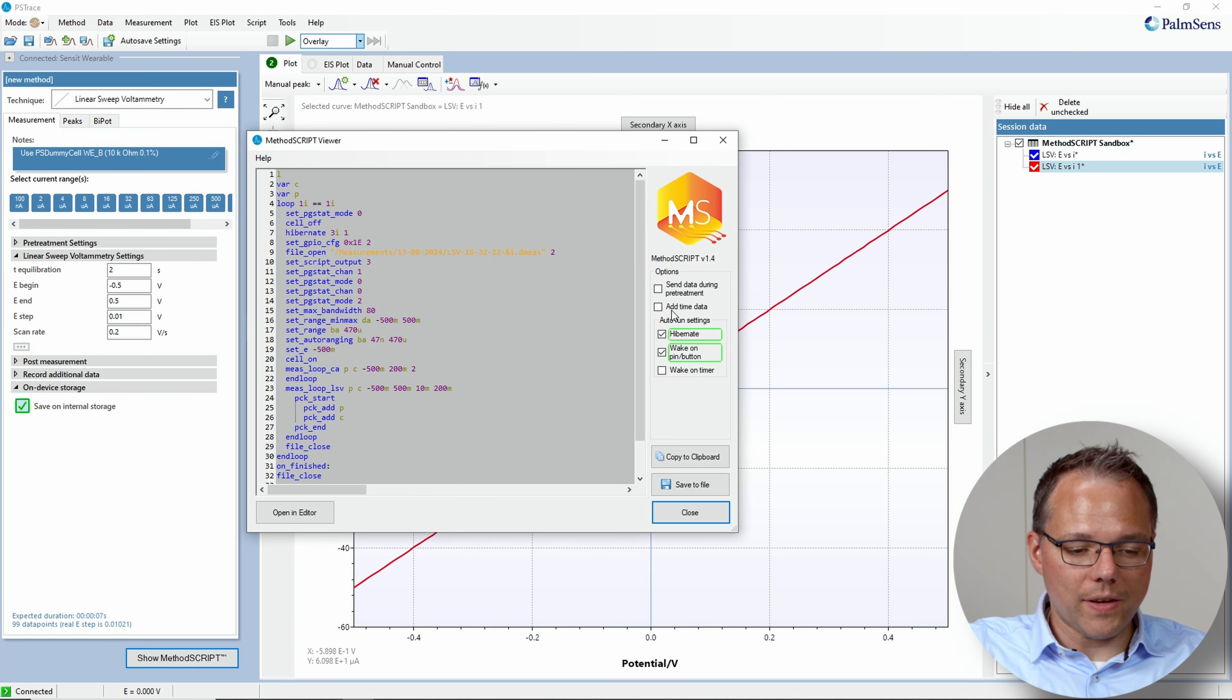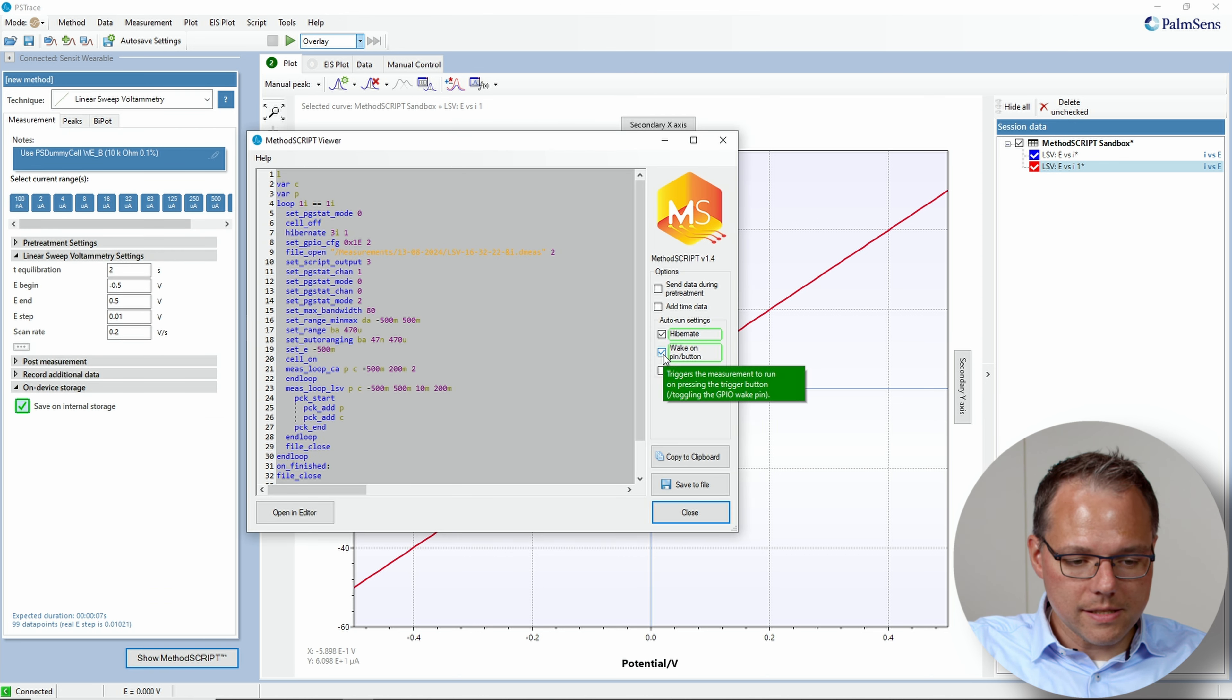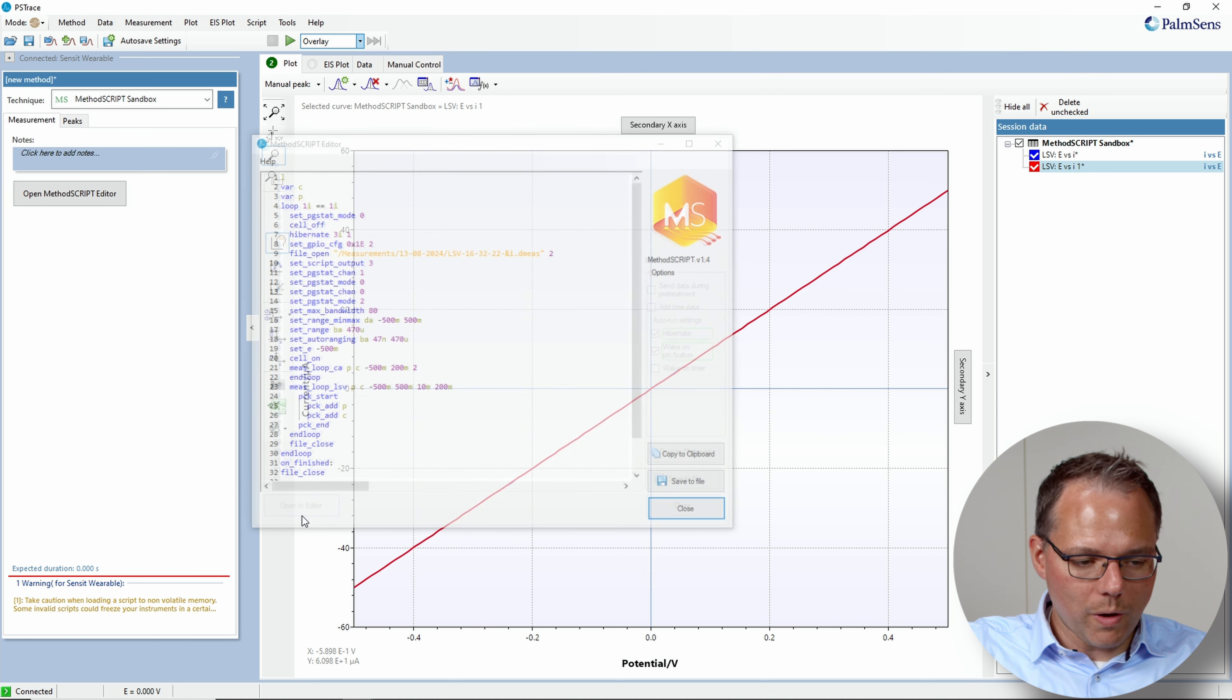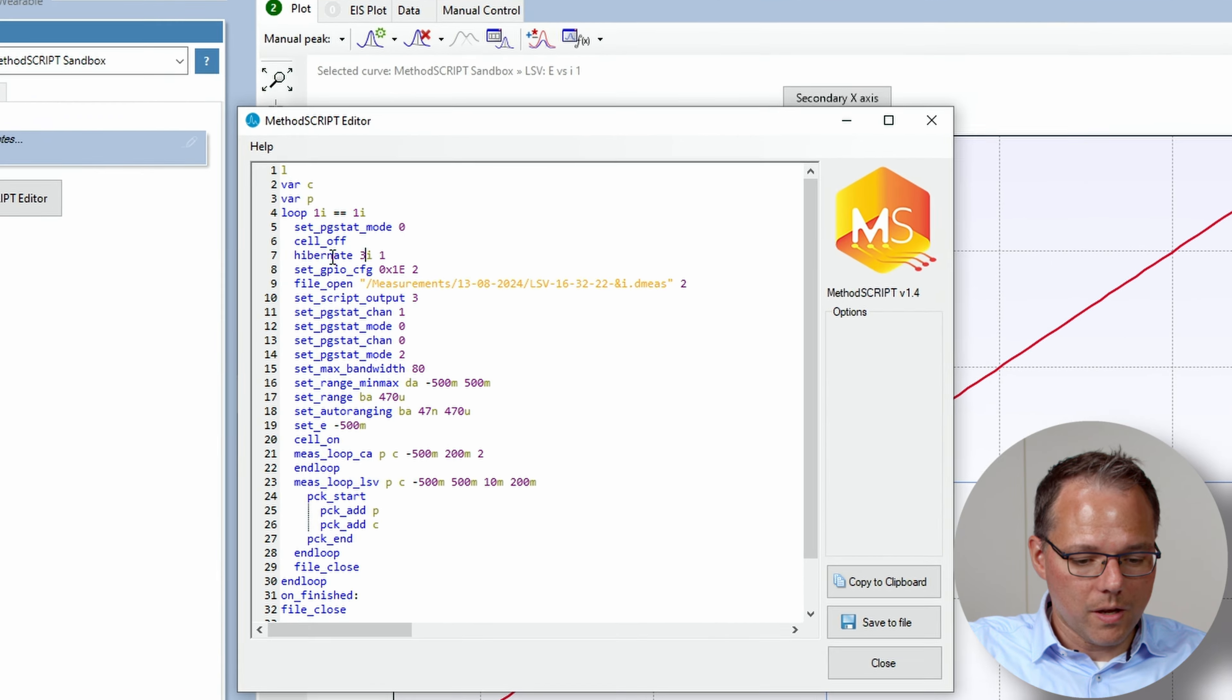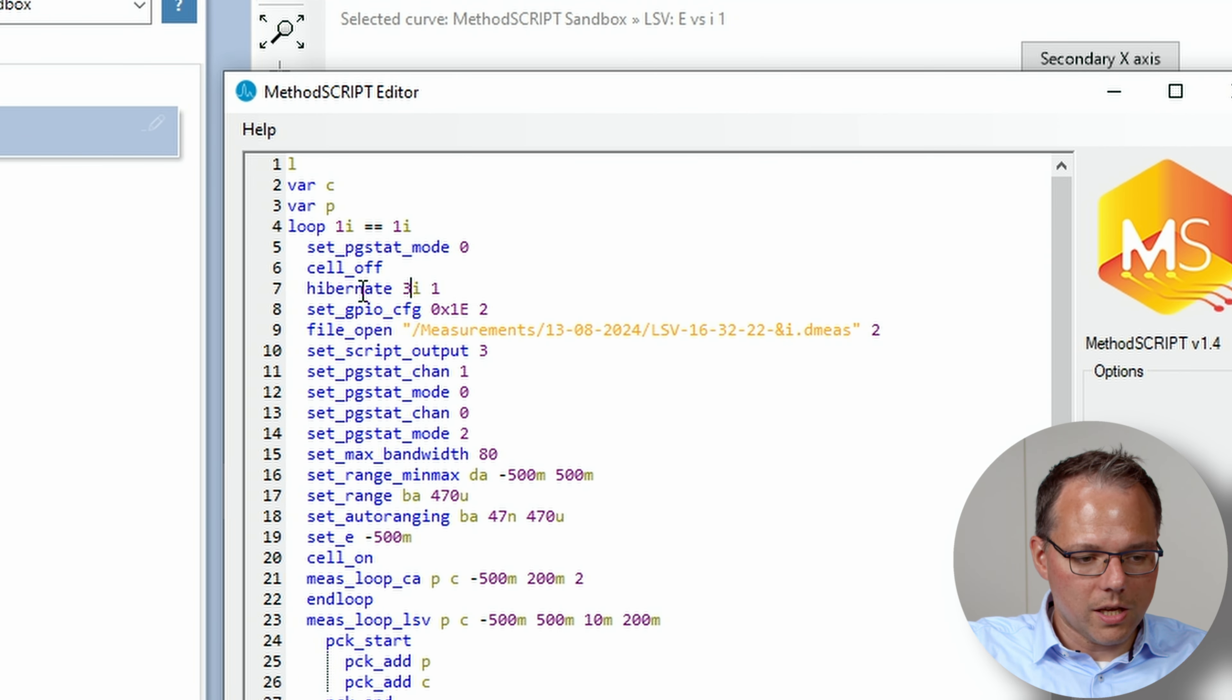We will activate an option for that. And that is instead of waking up on a pin or button, I want to wake it up when I tap it, because it does have an acceleration sensor. So I just need to change this number to 11.